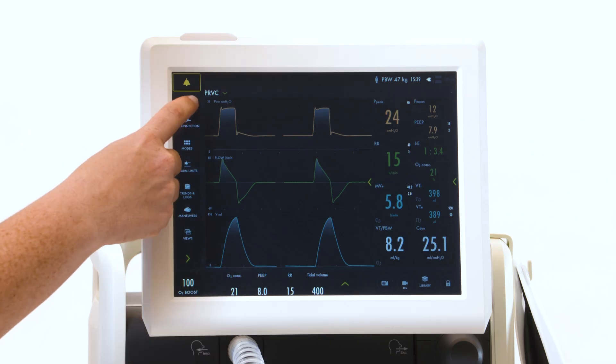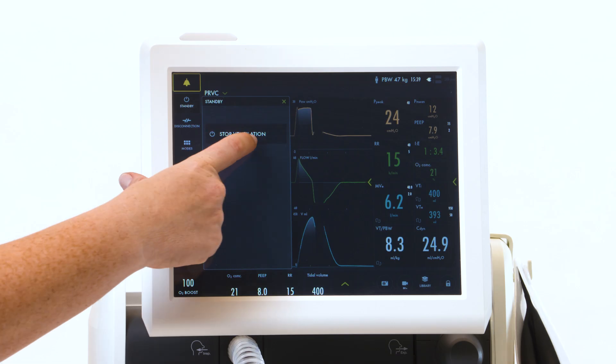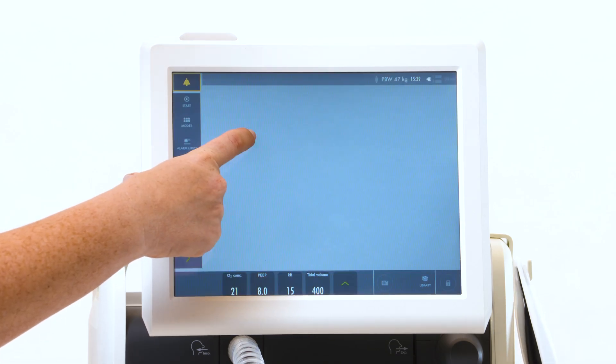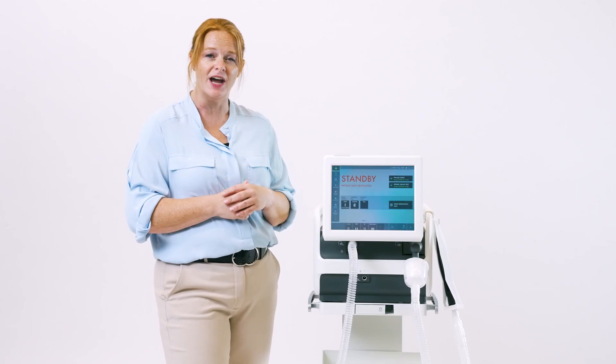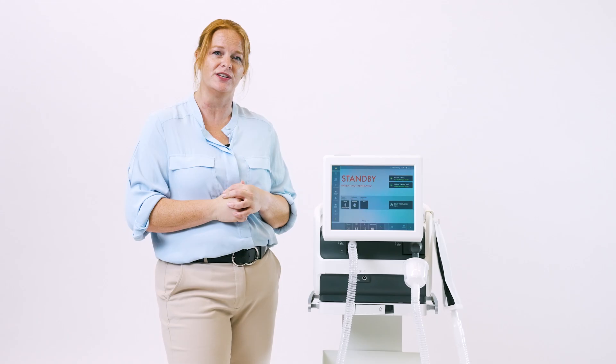To stop ventilation and go into Standby, touch Standby, and then touch and hold Stop Ventilation until the blue bar goes across. Now you can switch into Non-Invasive Ventilation if you would like.